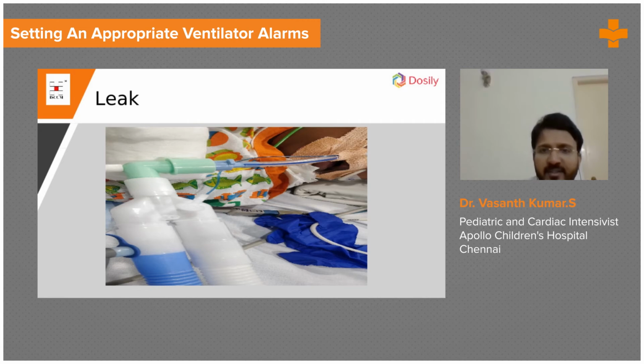So here if you see, this is your endotracheal tube. This is a Y connector. All ET tubes should have a Y connector. The circuit should not go directly to the ET tube, because this Y connector allows you to handle the circuit and move around the circuit. Here, this is a Puritan Bennett circuit. Here usually you'll have an opening. Most commonly, this is the cap for it.